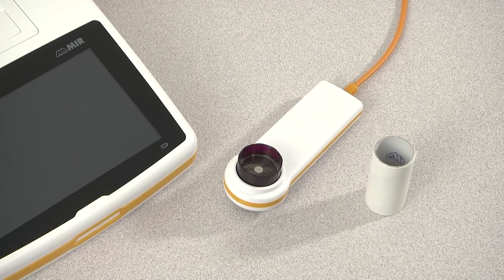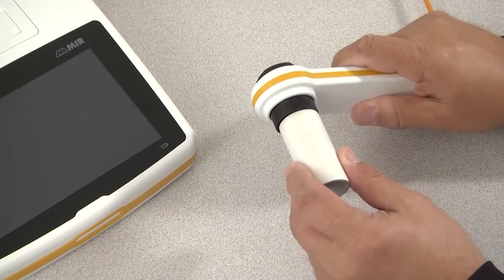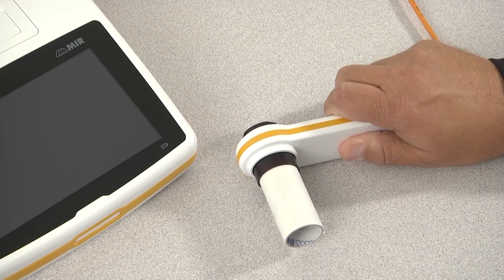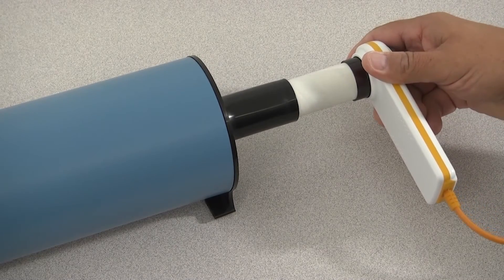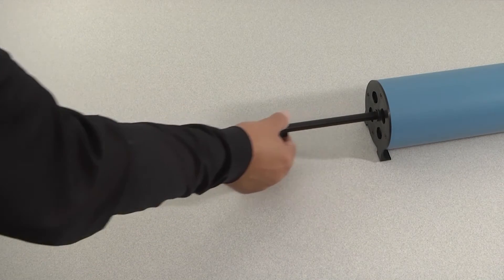To begin the calibration check, insert a cardboard mouthpiece into the flow meter. If you are using the Flomir disposable turbine, insert it into the flow meter. Connect the flow meter to the 3-liter calibration syringe, making sure you have a tight seal so there are no air leaks, and pull the syringe plunger all the way out.